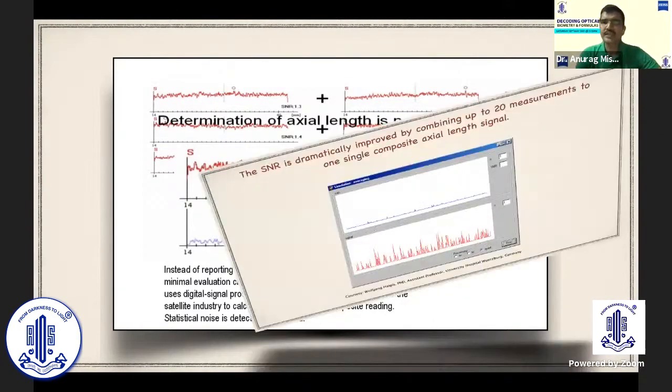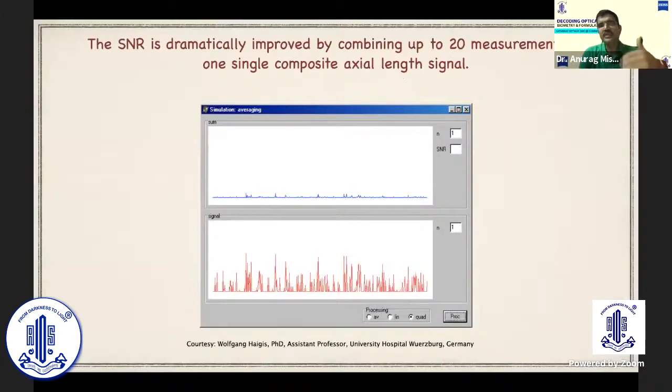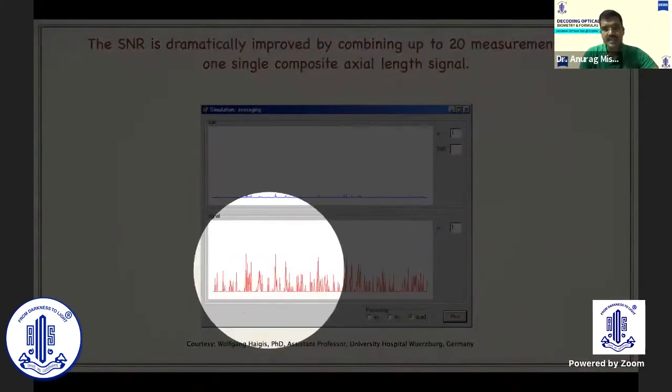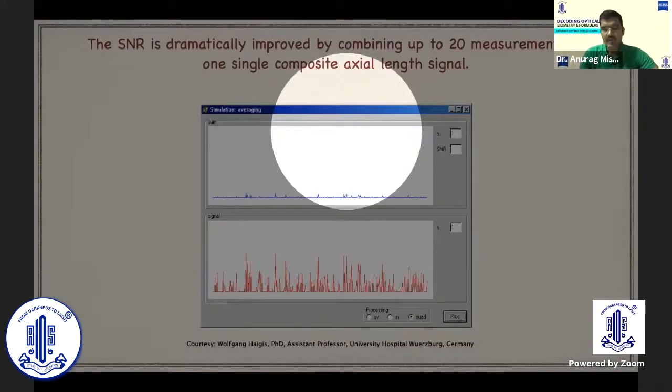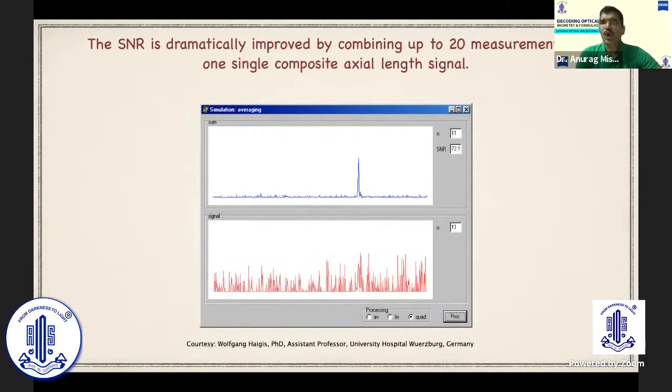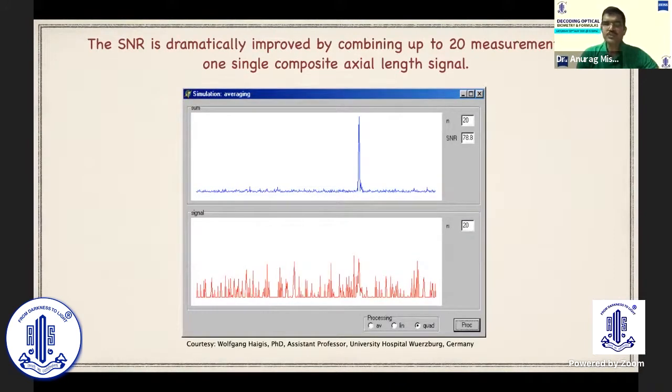It will be further exemplified in this picture. Keep an eye on these two columns right at the right hand corner. As we improve, as we go on taking repeated measurements from 1 to 20, keep an eye on the signal to noise ratio and you would see that this bizarre looking wave pattern now gives us a clear, unified, significantly tall retinal spike as the signal to noise ratio keeps on improving. So this was actually a breakthrough technology which was used by this machine to give us accurate measurements.